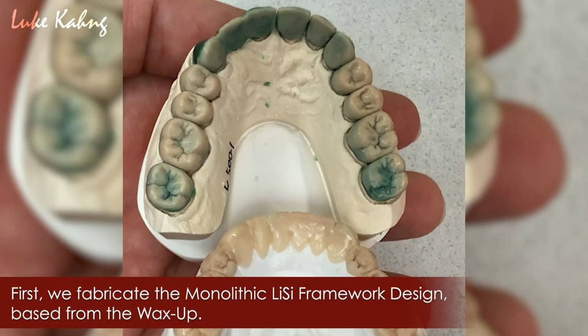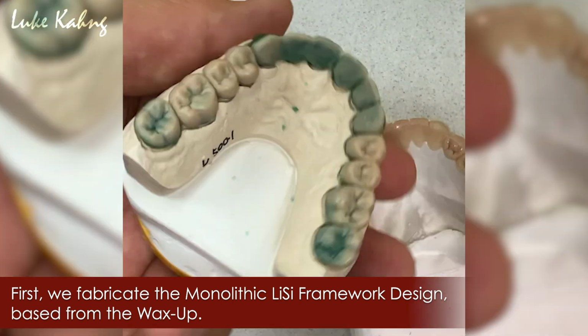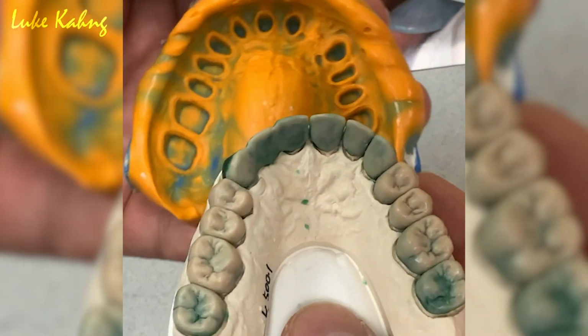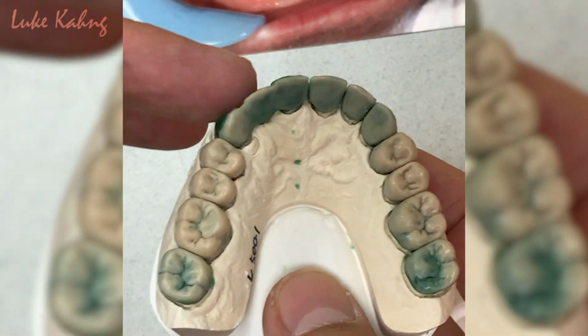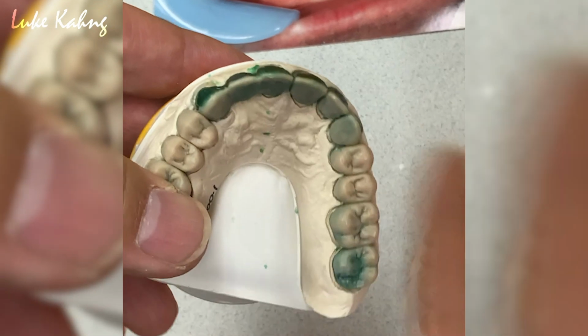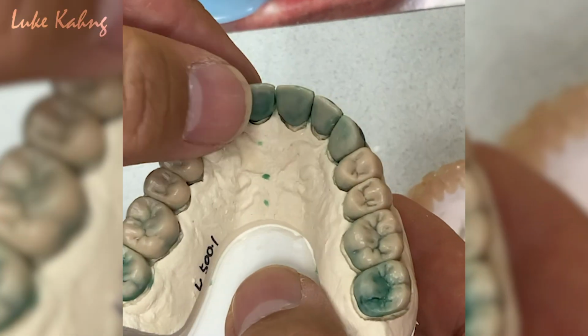Okay, great impression. We made the monolithic LiSi. Nice job from here. We took several impressions, so we chose this one. The temporary is really a pain in the butt to make, with the other side and the size and color and everything. So I'm going to give him a big discount for this, and we're going to make LiSi.